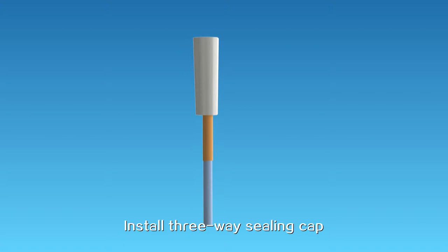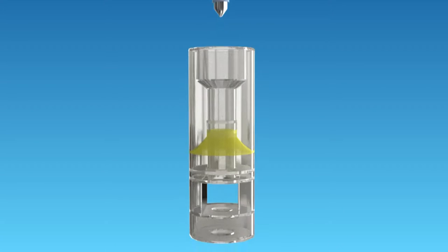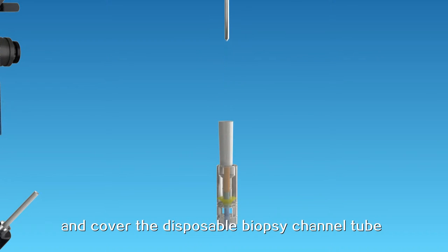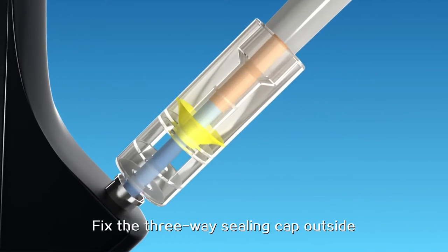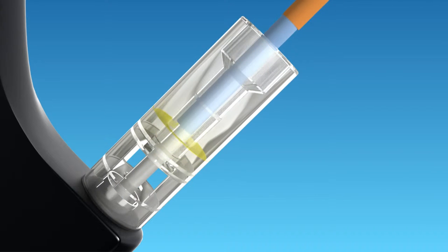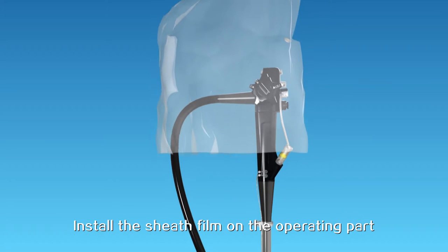Install the three-way sealing cap. Plug the guide cone in the tube and plug the tube in the sealing cap with the cone, then pull out the cone and cover the disposable biopsy channel tube with the front end of the guiding tube. Fix the three-way sealing cap outside the operation tube of the lens, pull out the guiding tube, and install the sucking-out tube and suction valve. Install the sheath film on the operating part of the lens body.